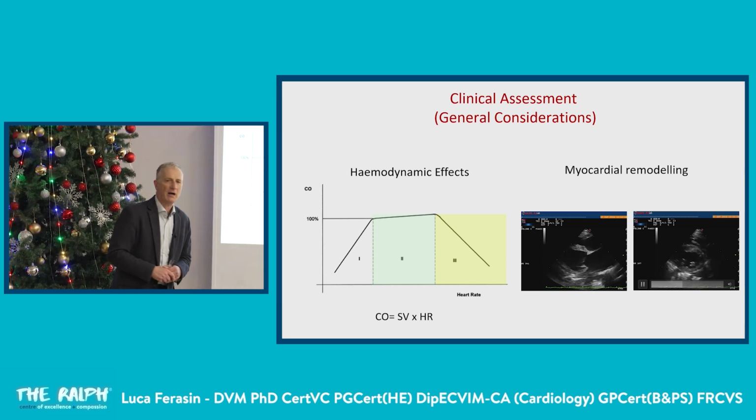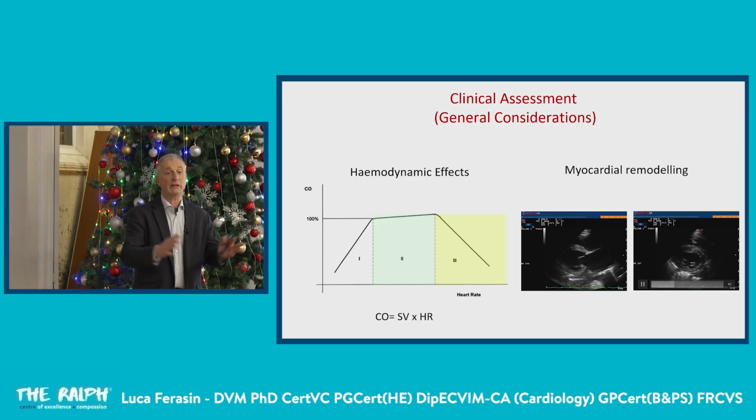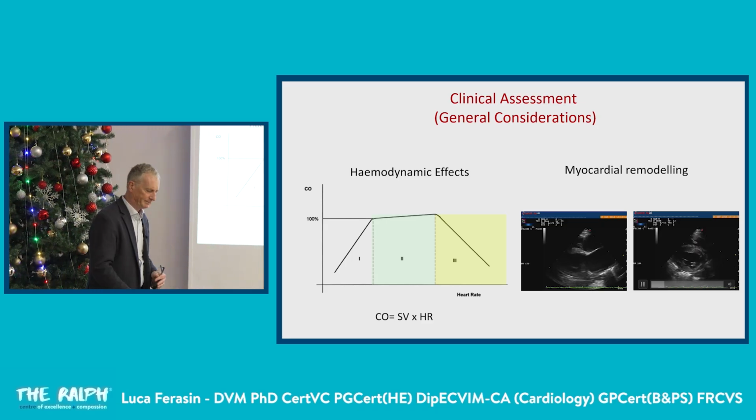And 24-hour ECG is the real gold standard test to do it, so you can see what happens during the day. And Holter recording nowadays is available to everyone.